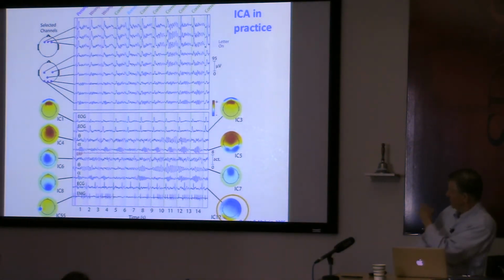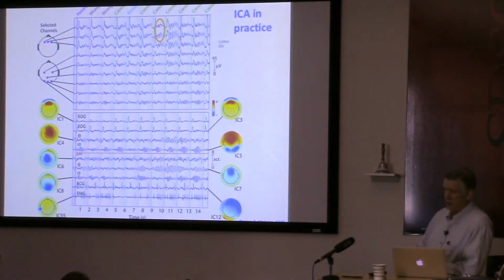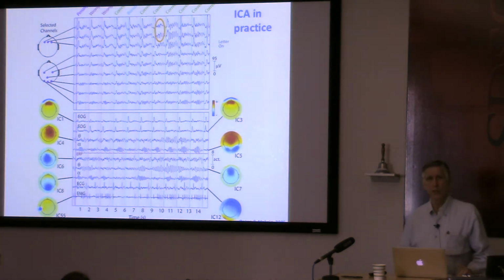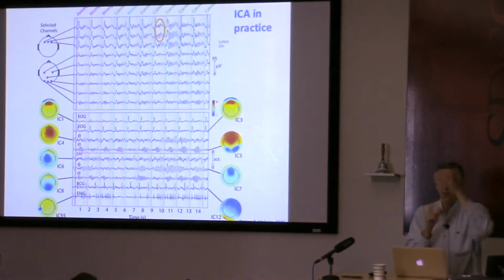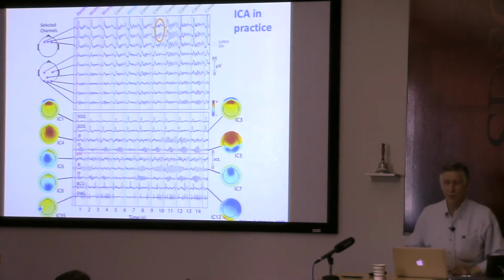Those aren't averages in any sense. Those are single trial, showing the single trial differences. And its projection to all the electrodes, even though it's very hard to see that in the raw data, and certainly no frequency filter or any other simple filter could take that out. And this was done, ICA doesn't know there is a head. It doesn't know there are electrodes, that there are electrode positions. It doesn't know anything. It sees each frame of the data as just a statistical collection of numbers, an ordered set of numbers, a vector of numbers.